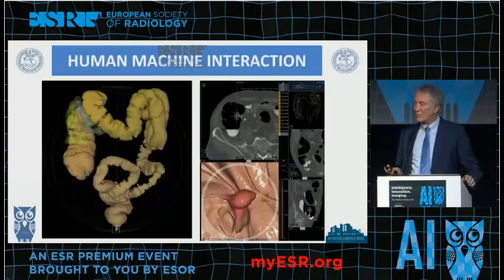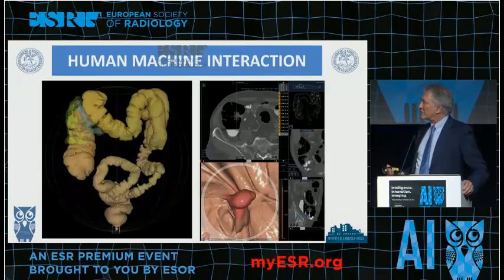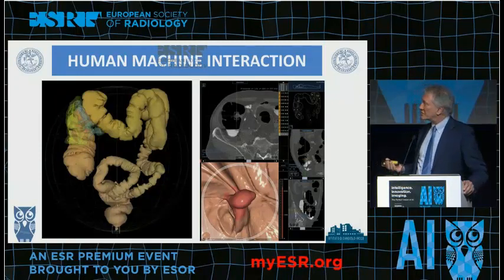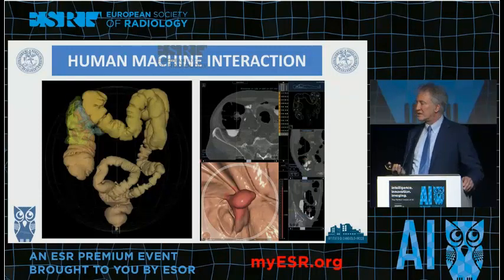And so also remember human-machine interactions, because we might have the most beautiful software in the world, but if radiologists are not used to working with computers, then it might be difficult. I'll show you this example, a CT CAD, computer-aided diagnosis tool we developed starting in 2003, so that was 16 years ago.